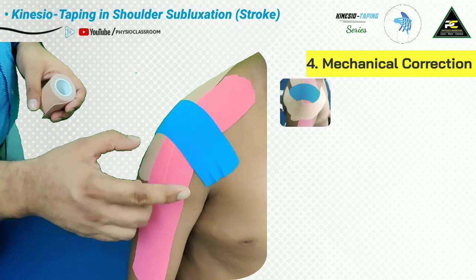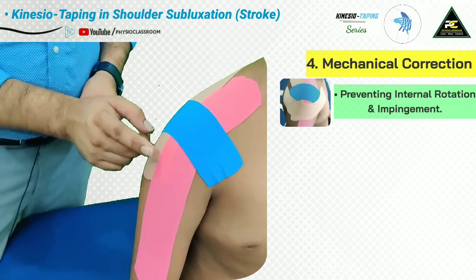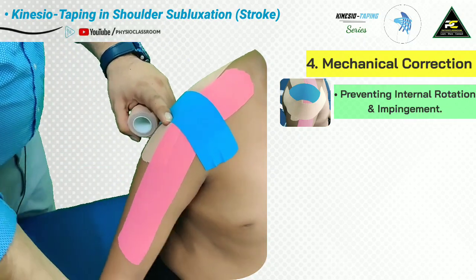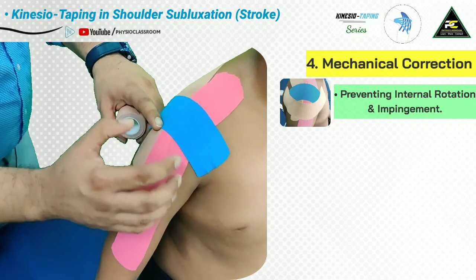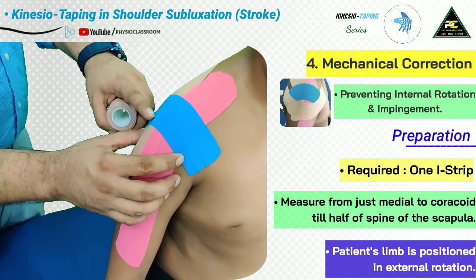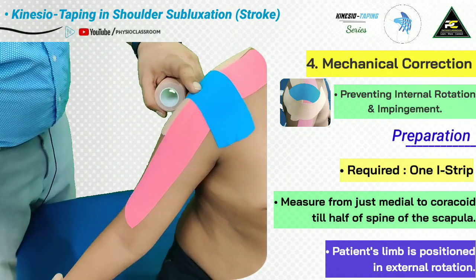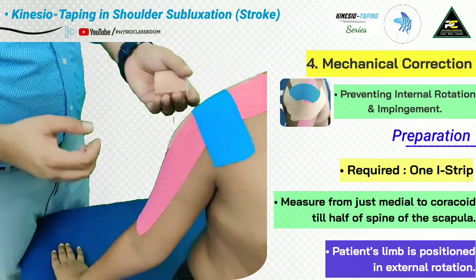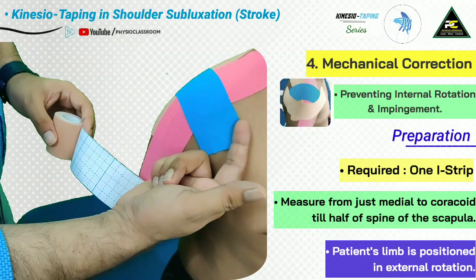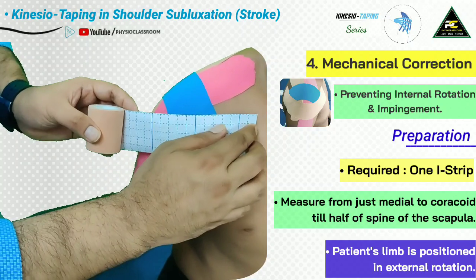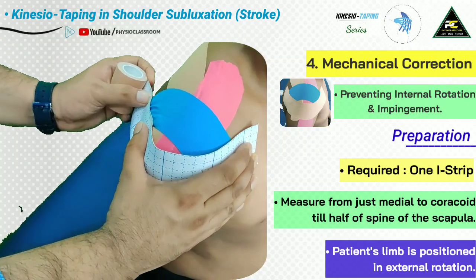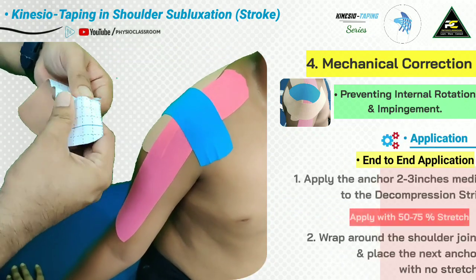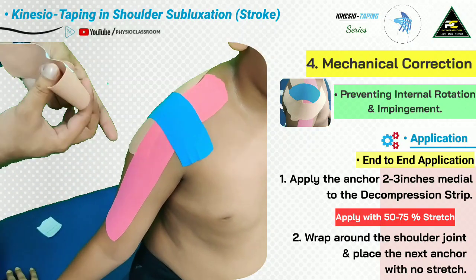The fourth part of the taping application addresses mechanical correction of the position of the humeral head within the glenoid cavity. The goal is to prevent abnormal internal rotation of the humeral head, which is often the common scenario. For this, the upper limb is positioned so that the humeral head is externally rotated. The patient sits in an upright posture, and the tape is measured from just medial to the coracoid process, around the shoulder behind to around half of the spine of the scapula. An anchor is created from one end, paper backing removed, and applied around two inches medial to the blue I-strip.